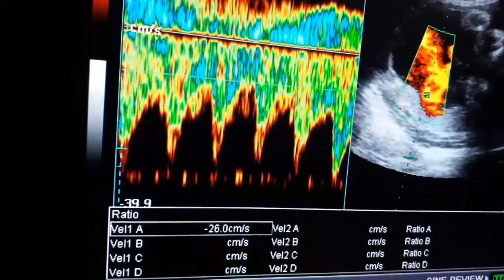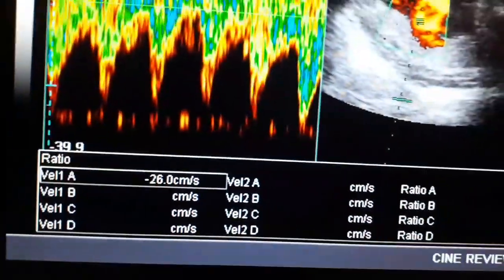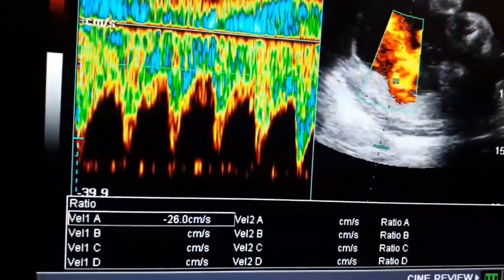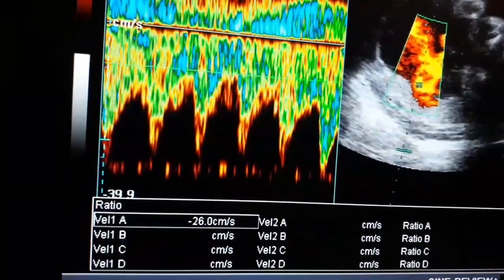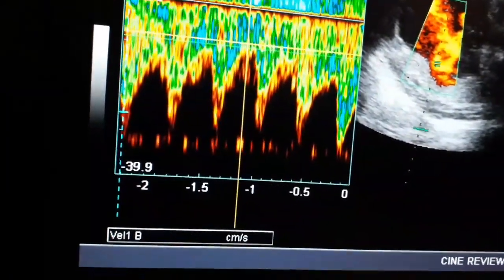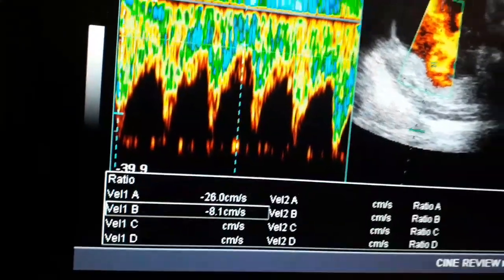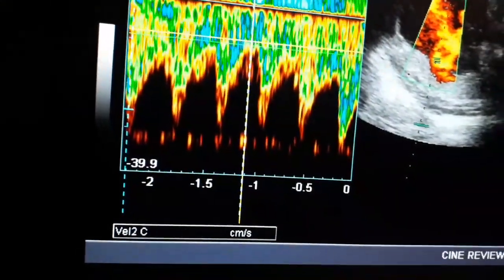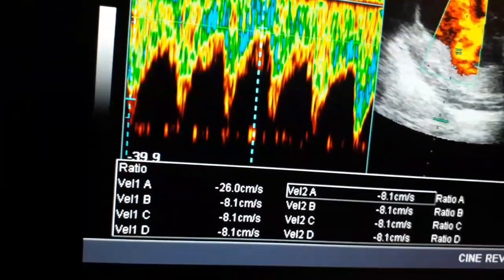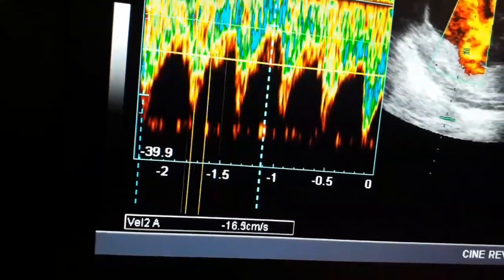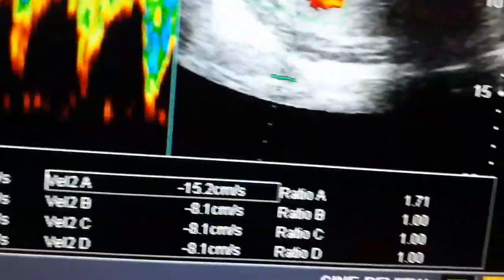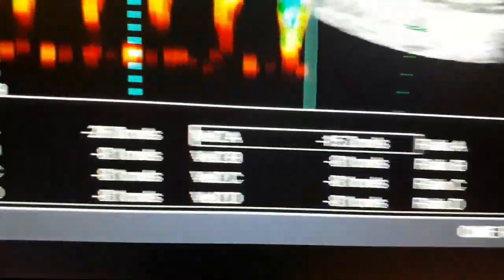You can appreciate that the S/D ratio in this case is about 1.7 to 1.8, which is normal. This suggests there is no sign or element of IUGR. I am taking the measurement to calculate the S/D ratio, which comes out to 1.71.